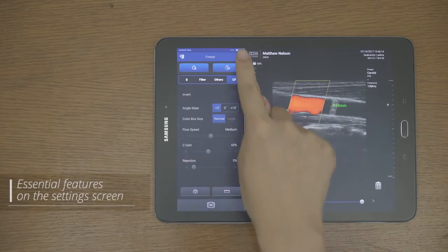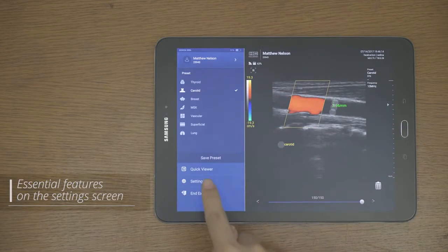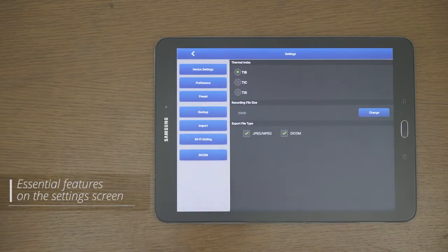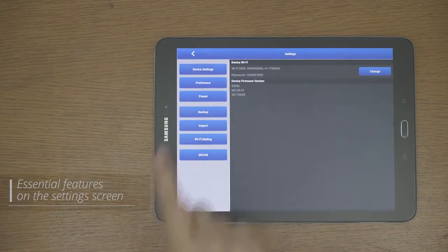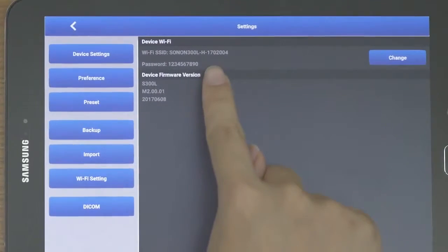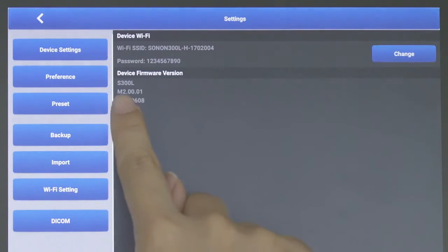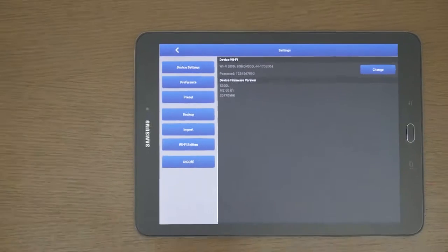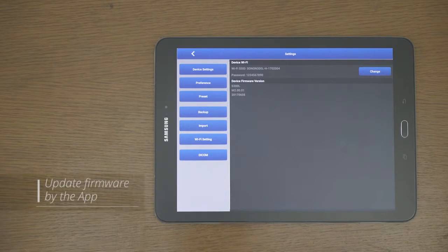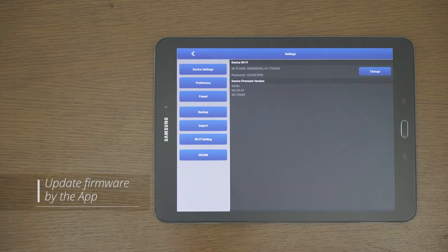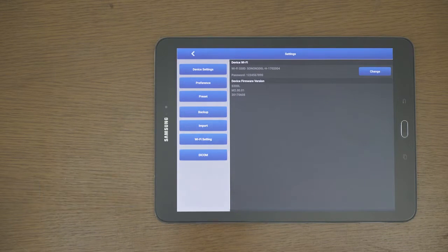Let's take a look at the essential features that users must know on the settings screen. The device screen shows the firmware versions of the app and Sonon device. Sonon can update the firmware by the app, so keep your app up to date.